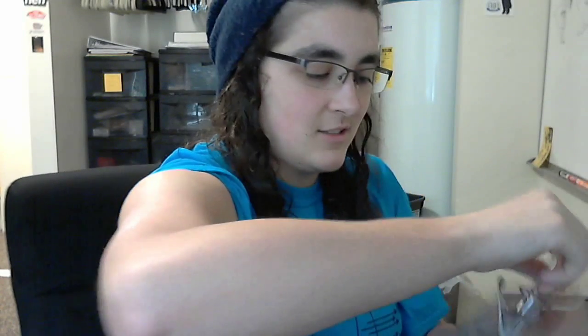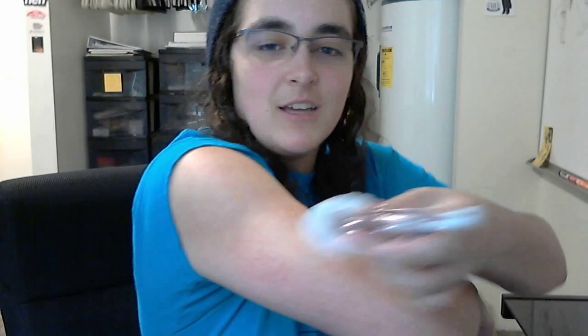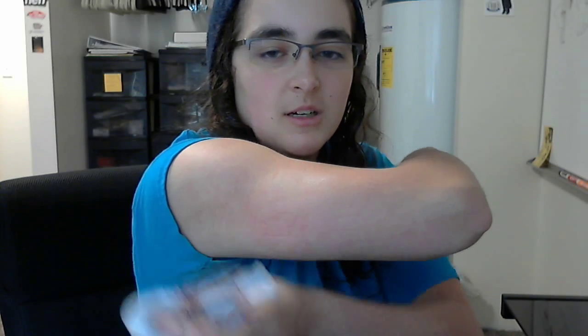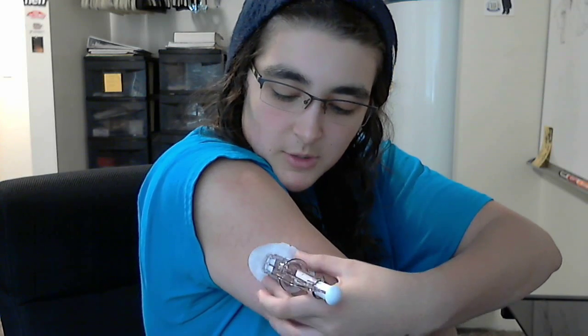And I'm actually rather bad at this. I'm not incredibly great with needles, and I've never been able to actually put it in at a good speed. It's always way too slow. And so I find a spot on the back of my arm normally that isn't too far under so that I don't hit it when I put my arm down, because that really bothers me. But also it's still pretty much on the back. So I find a nice spot.